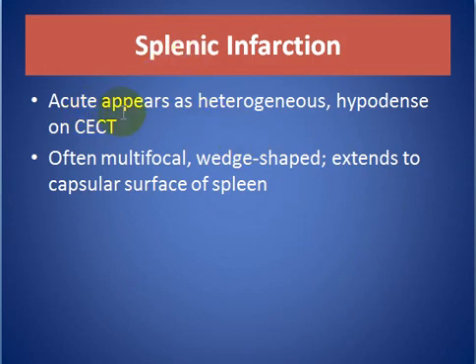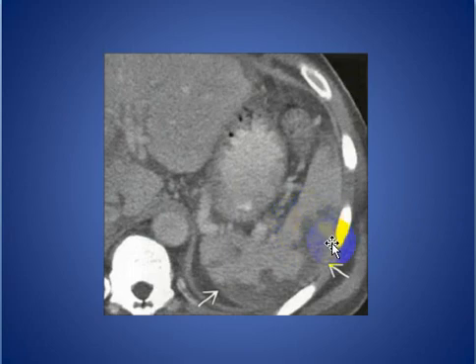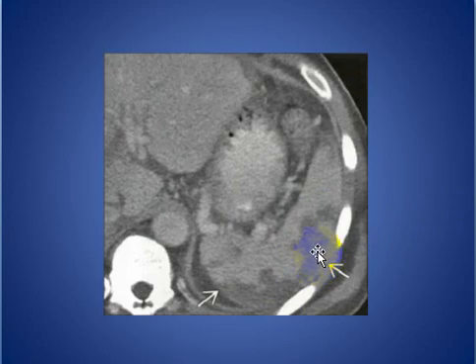Splenic infarction, acute, appears as heterogeneous and hypodense on contrast-enhanced CT scan, often multifocal, wedge-shaped, extending to the capsular surface of the spleen. As seen here on axial contrast-enhanced CT, multiple subcapsular hypo-enhancing foci in the spleen in a patient with portal hypertension due to splenic infarction.